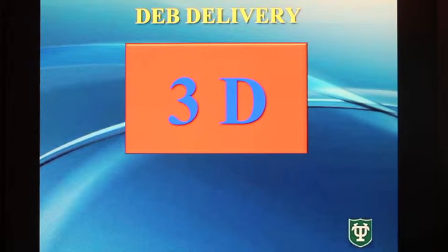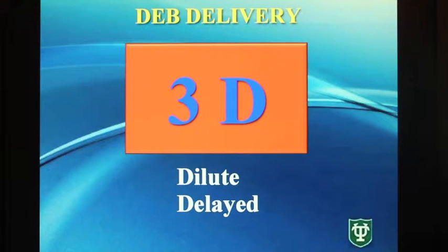Now we talk about 3D delivery, and what that is, it's dilute. What we do is we dilute 5 to 10 to 1 to the cc of drug-eluting bead, so that it more readily can go to the area of involvement as opposed to stacking up proximal or central to where we want it to go. We use delayed delivery in that we wait in between injections and we deliver slowly.